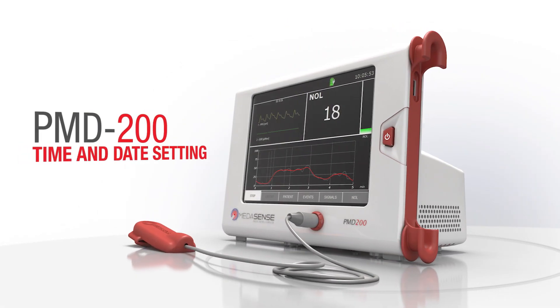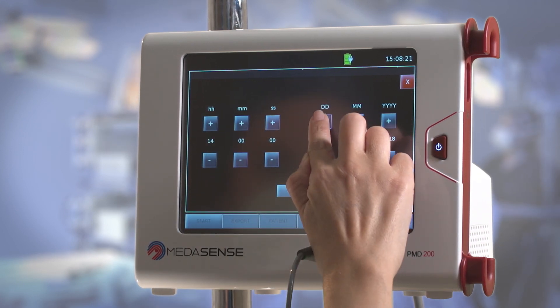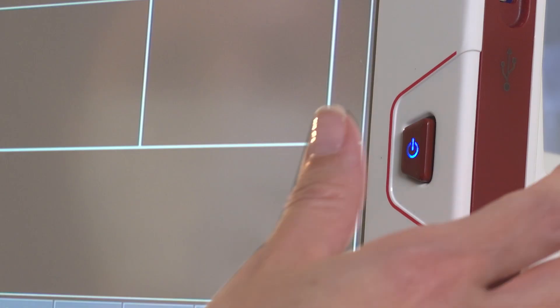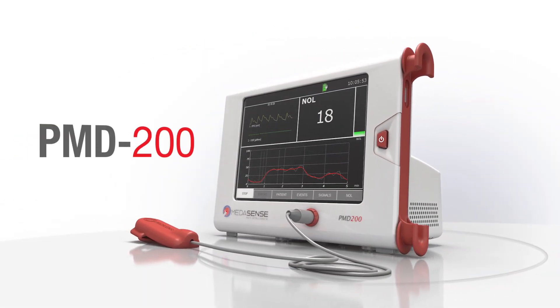Time and date setting. To adjust time and date, press the Display Clock while not in a monitoring session, then adjust time and date. To power off the system, press the button on the right side of the monitor. You have just learned how to operate the PMD200 system.